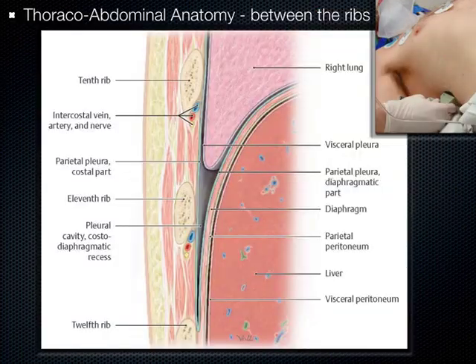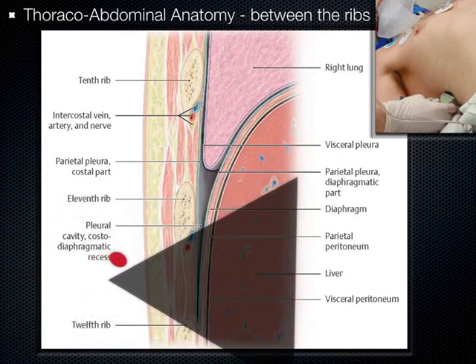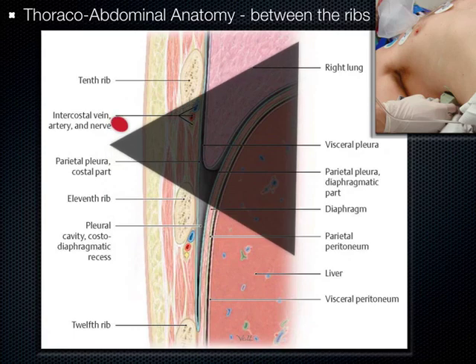This is the space, again, where you're placing your diaphragm, and this area is where you want to image. People's diaphragms are in different places. People don't necessarily read the textbook. COPDers have very low diaphragms because their lungs are hyperinflated. Some people have great big livers and their diaphragms are up in their armpits. So you need to look around and find out where the diaphragm is. Don't just assume.